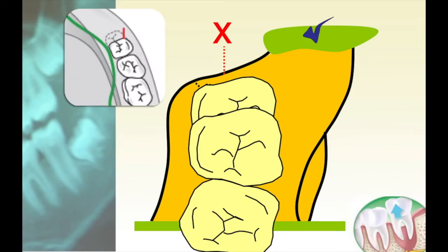On the access side, we do remember that the aim of flap design would be to gain access, to prevent tissue dehiscence, as well as prevent flap necrosis. There are principles in flap design that address these goals. A couple that is reiterated in this diagram is we do not cut across vital structures.